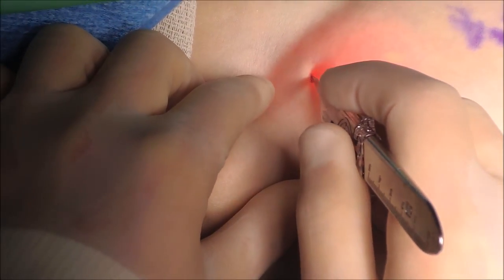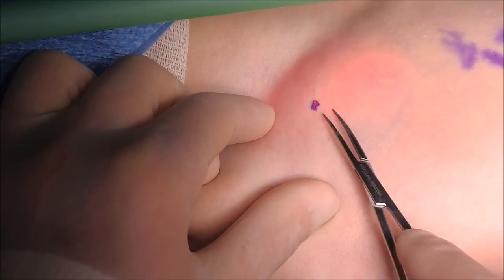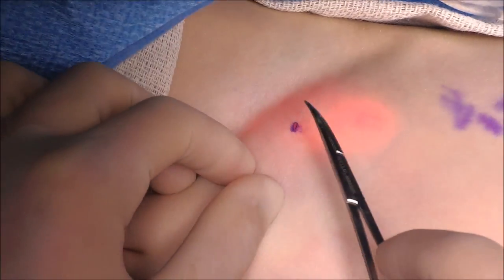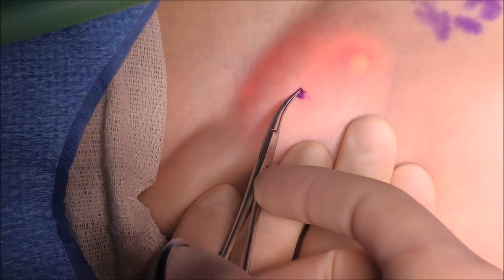Inside, just with the stab of an 11 blade knife, the skin is separated from the underlying fat to allow some room for the suture.